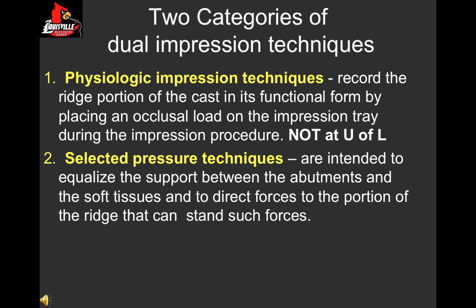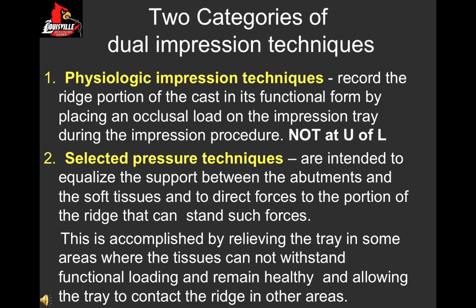This is accomplished by relieving a tray in some areas and allowing the tray to contact the ridge in other areas while taking the impression.